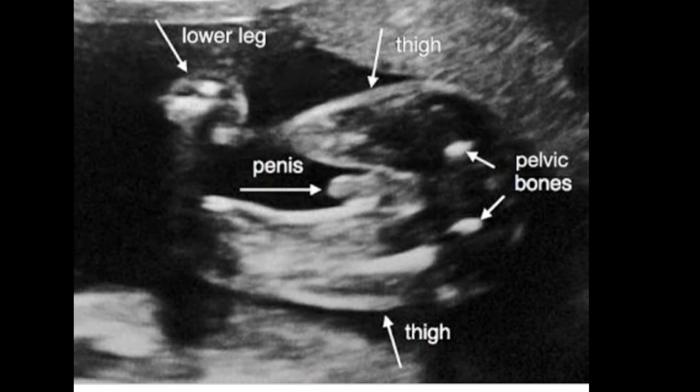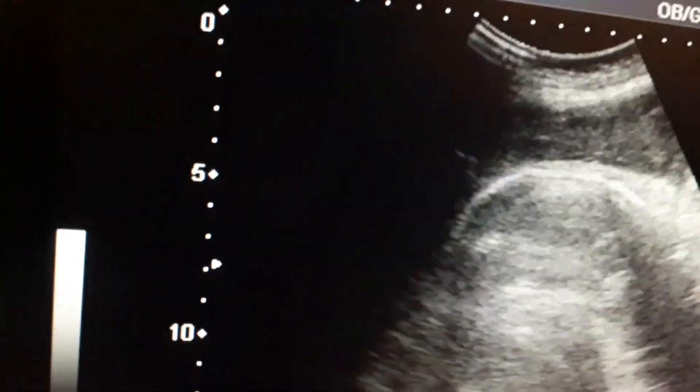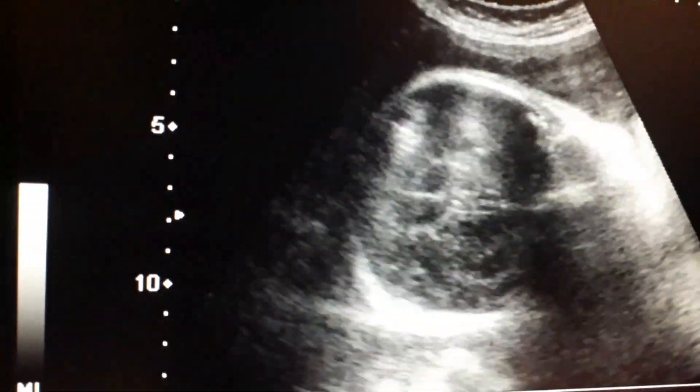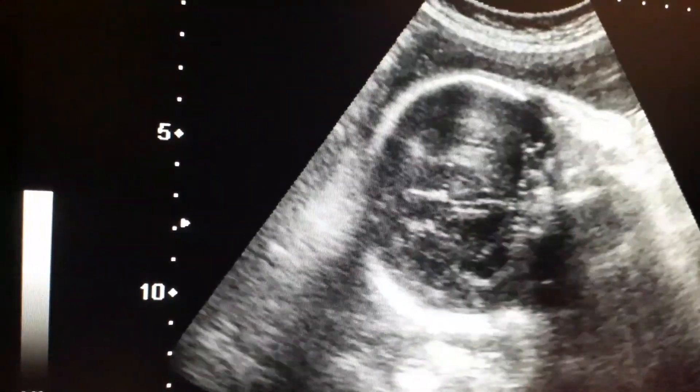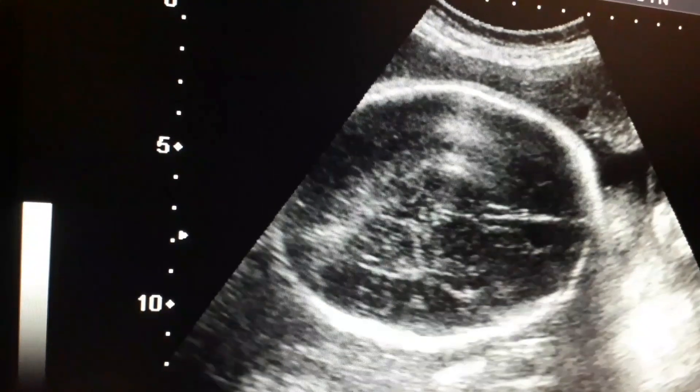This video is about a breech baby with male gender. This picture shows the penis between the femur bones. This is a 36 to 37 week pregnant lady having a breech baby with male gender.